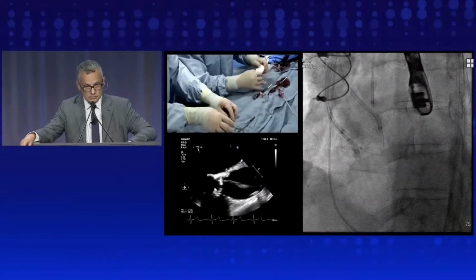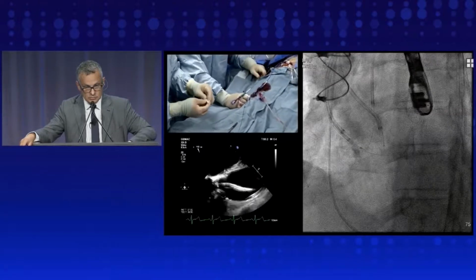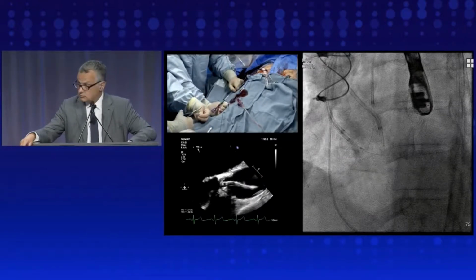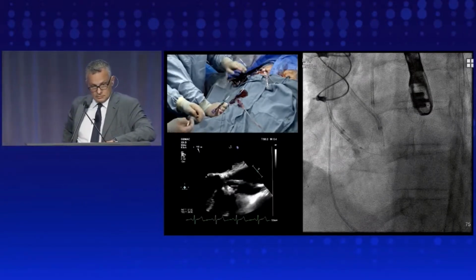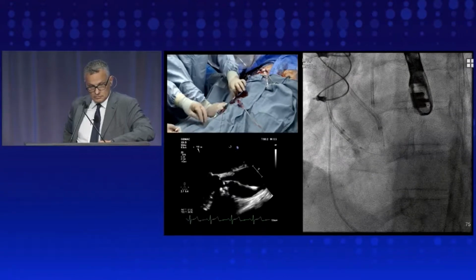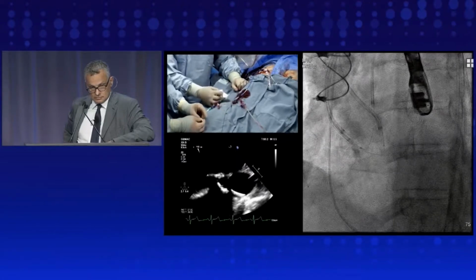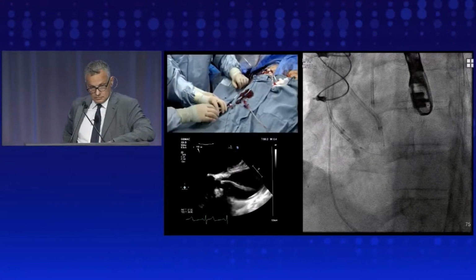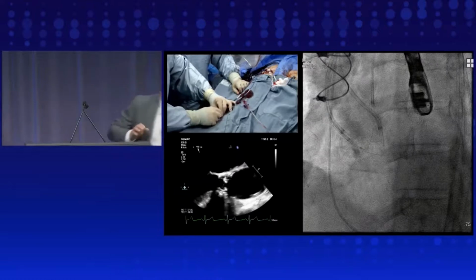So our aim, maybe we'll show what we have with regard to catheters. We have a 16 French dry seal in the right femoral artery. We have 2 arterial sheaths in the left femoral artery that were utilized for the left cusp loop. One is 8 French and one is 6 French. Through the 16 French dry seal, we created now the loop in the right cusp using the 2 multi-purpose catheters that you just saw. We will do the laceration of the right cusp first in order to have the big sheath ready for us for TAVR implantation. So that will be the first cusp that we'll tear.